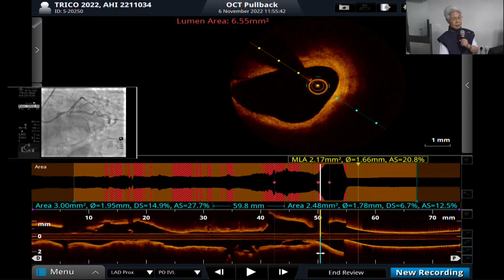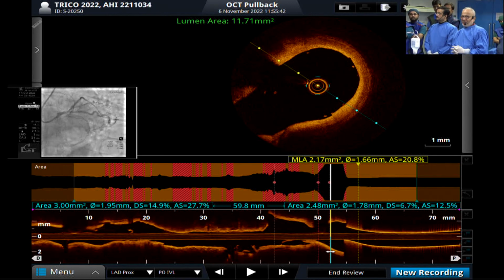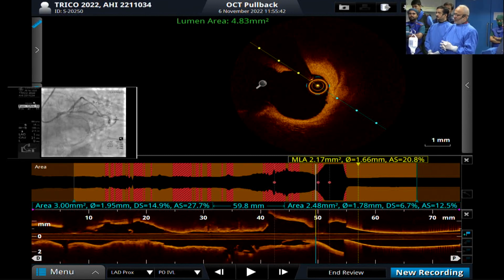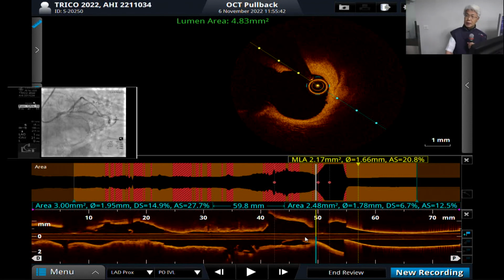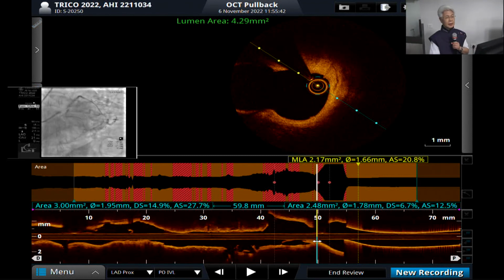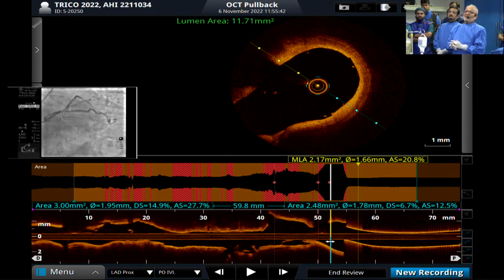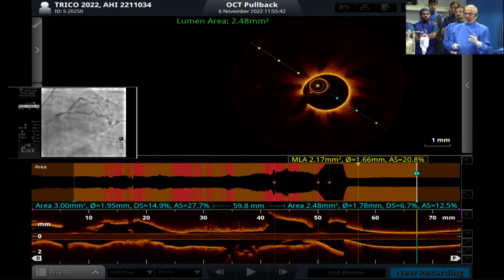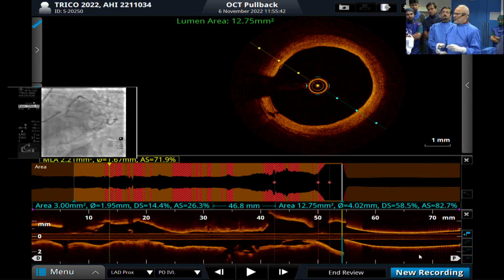So my question to you guys is, should we include left main and stent LMCA to LAD, or we can find another spare branch, just distal to the CX? We can identify some branch. I'm sure there is a middle branch a little bit. Yeah. So I think I would go to left main because you will get good expansion. So I will use two stent strategy here. Distally I will use 2.5 and proximally 3.5, and then I may post dilate with 4 or 4.5.